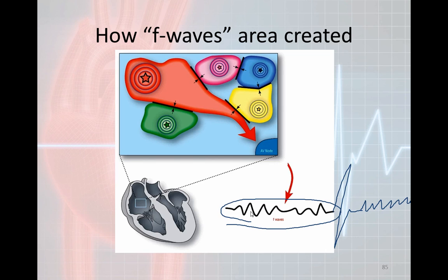Unfortunately, you cannot determine an atrial rate in an atrial fib. You can't count this and say, well, here's one, here's one, here's one. You can't do that. There are so many depolarizations occurring up here in the atria that very commonly your atrial rate is actually somewhere between 400 to 700 beats per minute. So most of the time for an atrial rate, it's NA because you can't determine what it is. It's too fast to count.